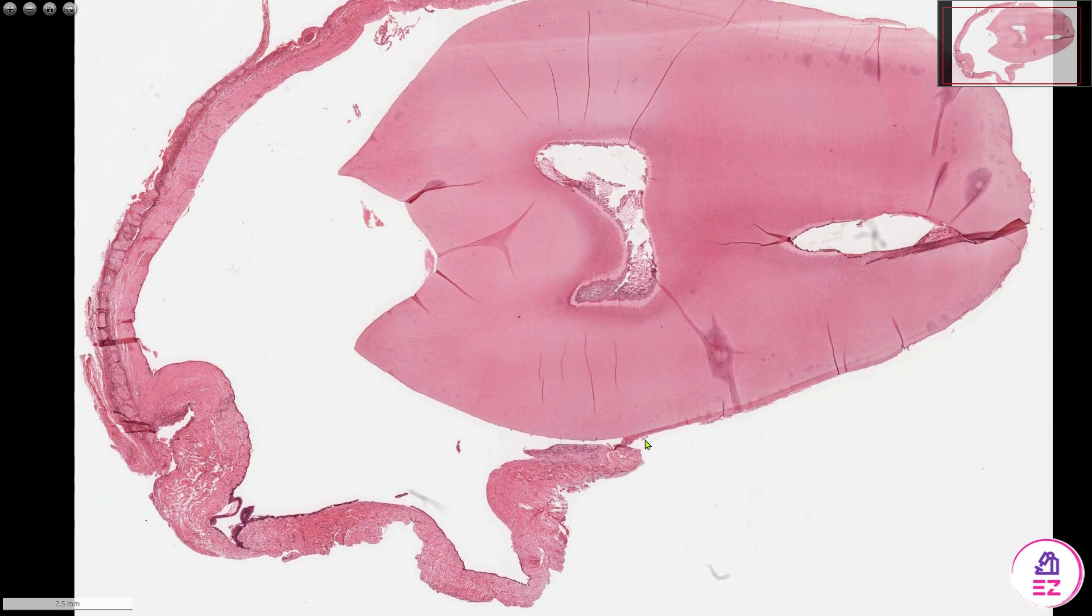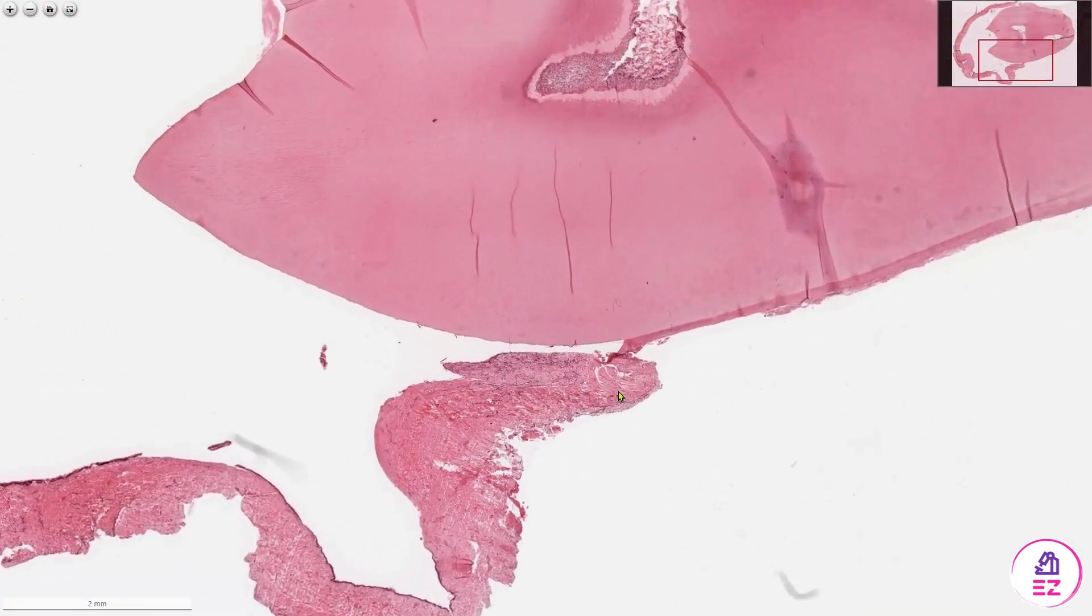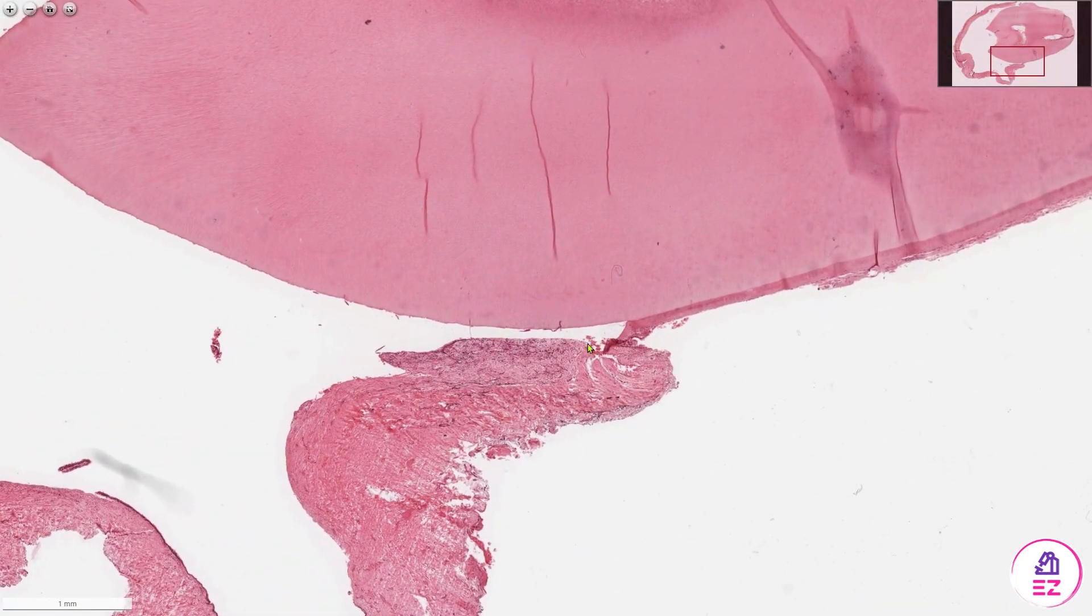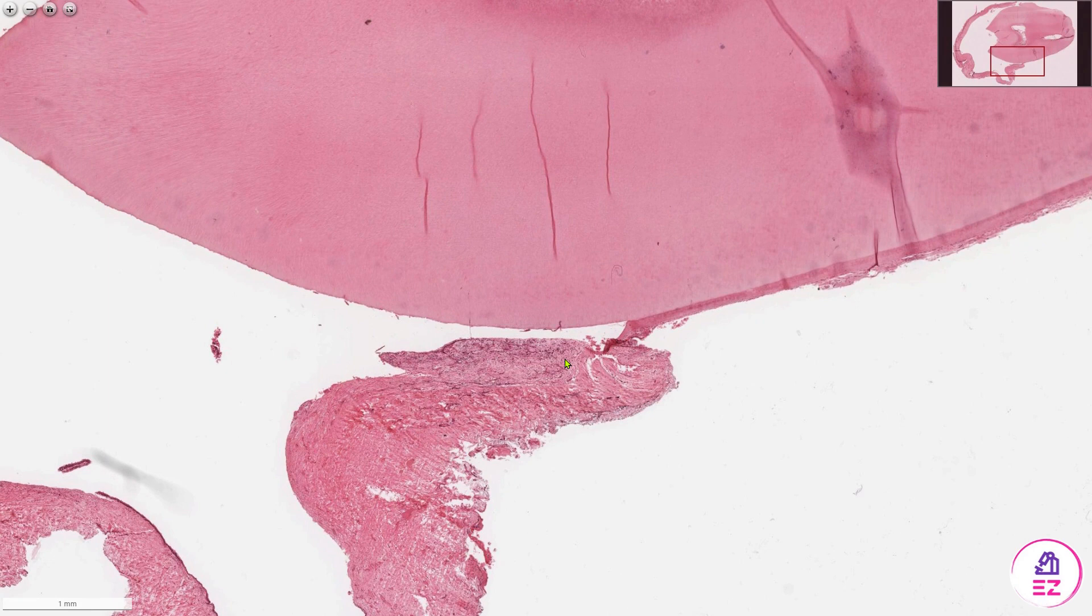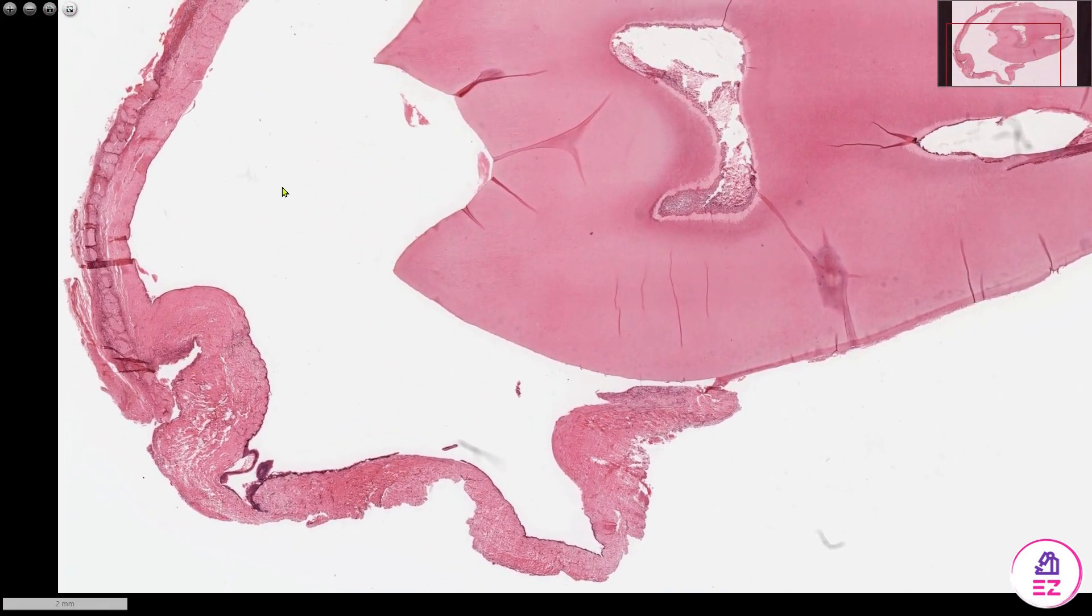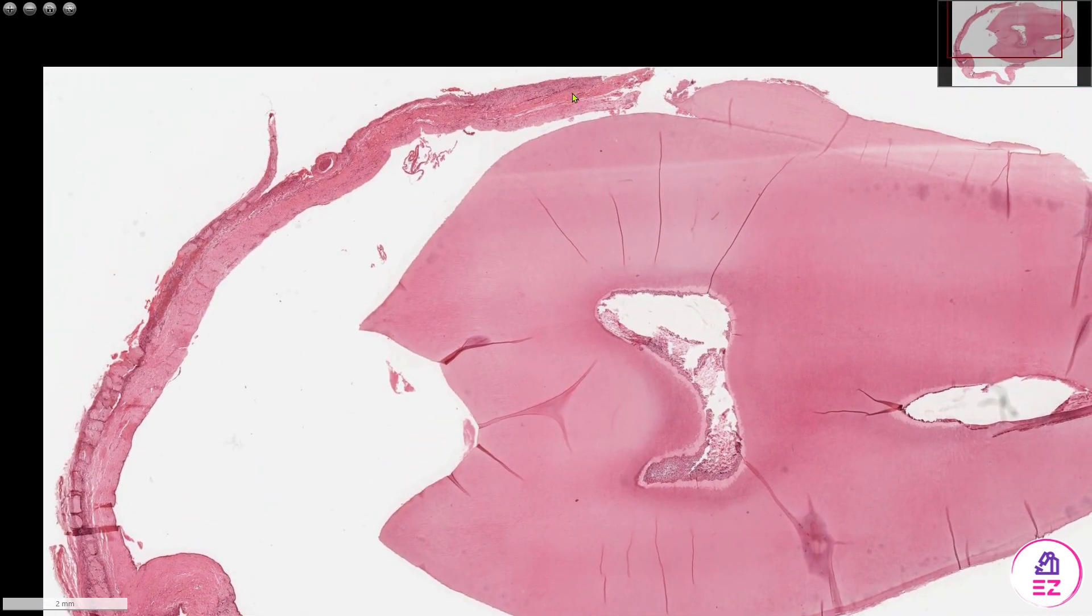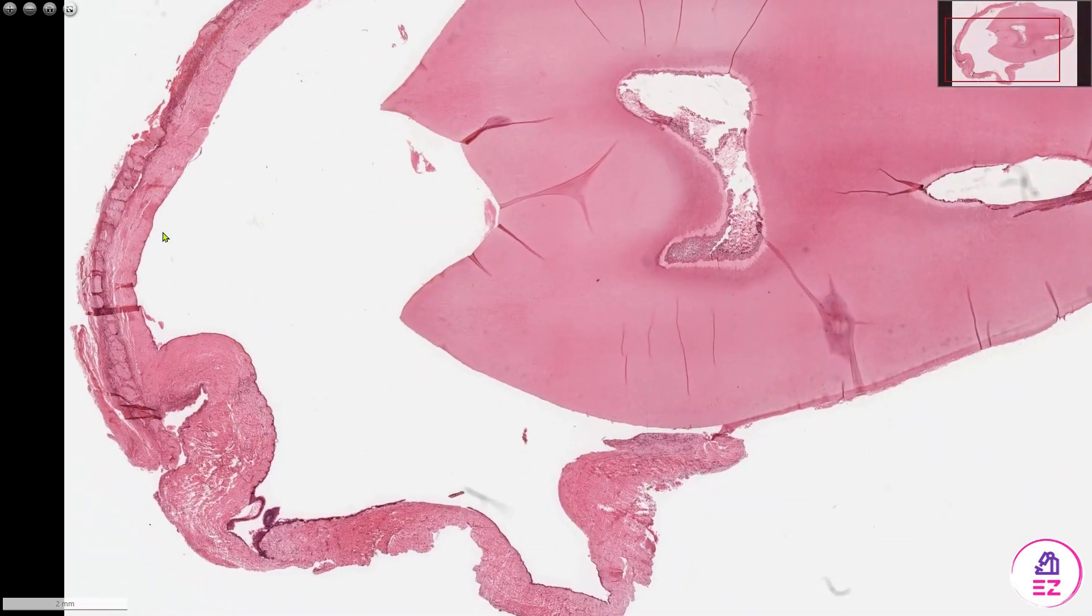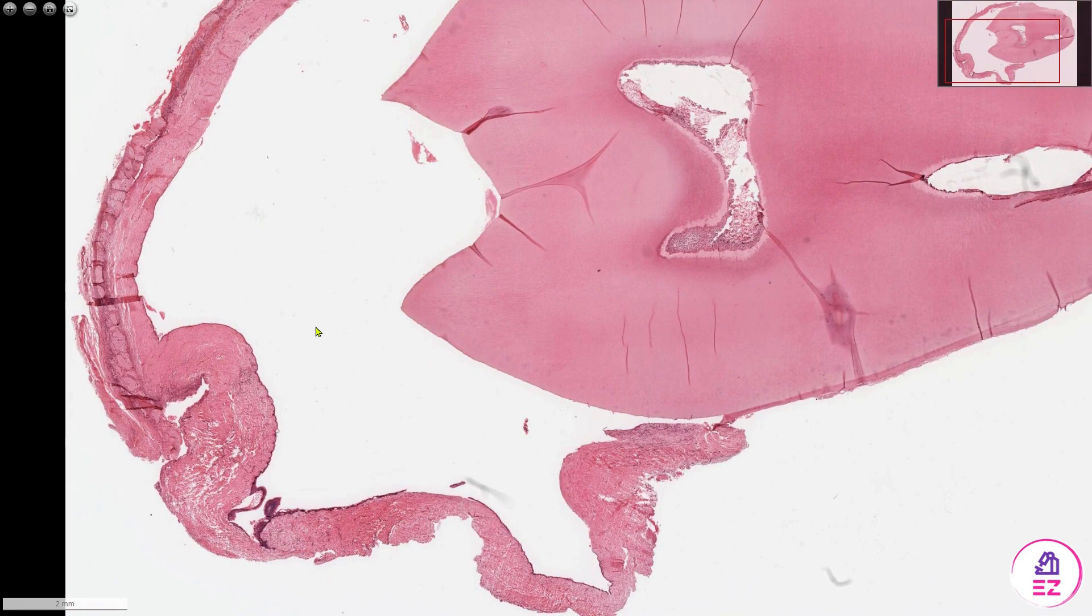So here's the cyst, and here's the tooth. Point number one is that this cyst is originating from the CEJ of this tooth and enveloping the crown, so it's a pericoronal cyst, hence why it's in keeping with a dentigerous cyst.